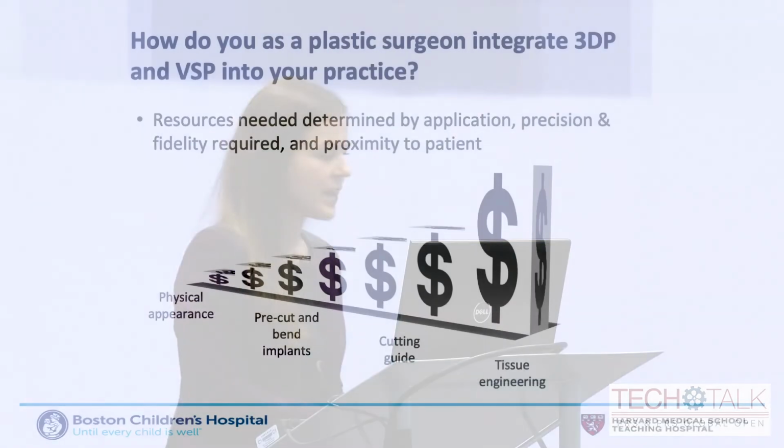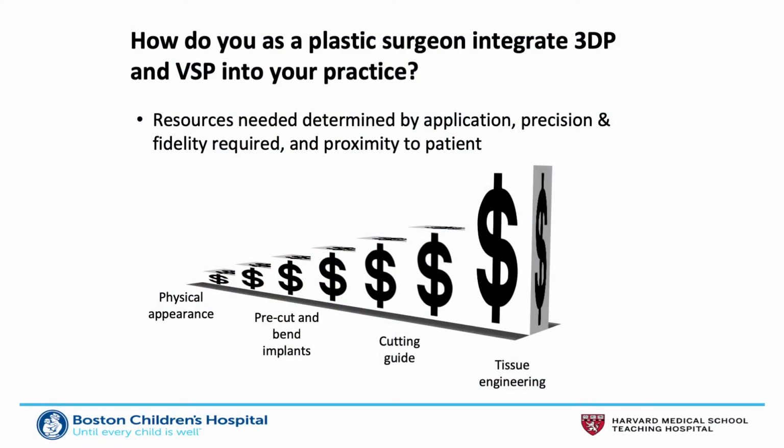Similarly, you don't actually need a large investment to jump into actually making 3D prints. The amount of the investment is really a function of what the purpose of your print is, and the closer your print gets to the patient in a literal sense, the more costly it's going to be. For example, if all you want to do is simple modeling to understand anatomy, to educate patients, and to practice surgical procedures, you can do this at really low cost with things like a basic extrusion printer, which just spits out some material and makes a three-dimensional shape. If you actually want to print cutting guides that are going to come into contact with the patient, it's going to be more expensive because it needs to go through a process that's actually regulated by the FDA.